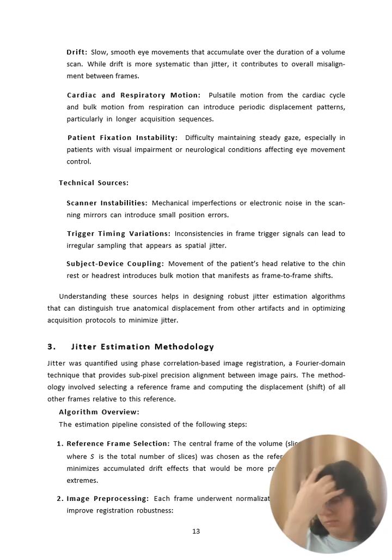And this movement is comparable to the scanning rate or the frame acquisition rate. So we characterize jitter on the basis of magnitude, direction, temporal pattern, and what its impact is when we average it out. We will further move on to image registration algorithms, and it's important to understand jitter before that. It provides quality metrics for the acquired volume, and that is what makes a scan good or bad.